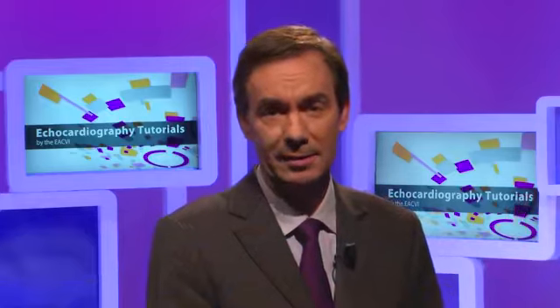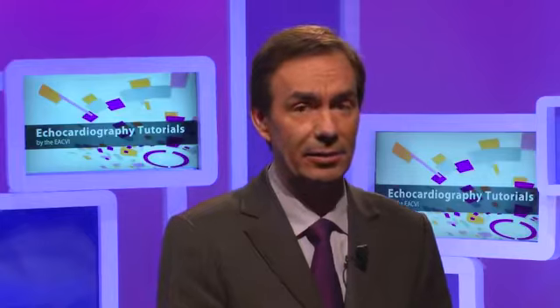How to assess carotid stenosis with ultrasound. That's what Muriel Springer will show us. She will first show how to prepare the patient, then the morphological characteristics of the carotid arteries and plaques, and then she will move to how to assess the carotid stenosis severity using the most appropriate method.